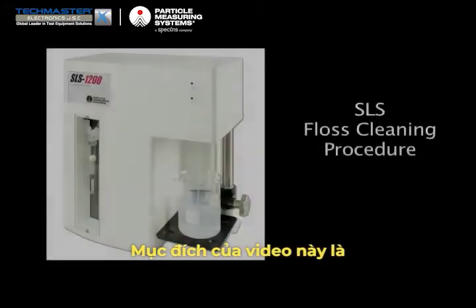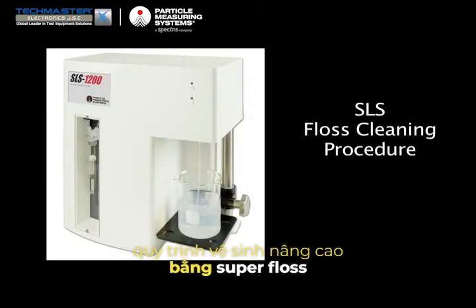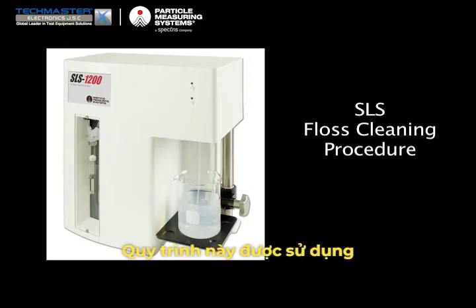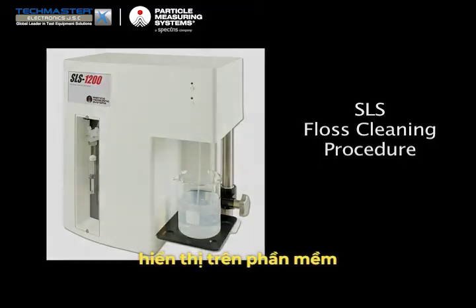The purpose of this video clip is to demonstrate the simplicity of performing the more advanced floss cleaning procedure that you will use if the sampler syringe method does not sufficiently reduce the DC light value displayed on the software interface.